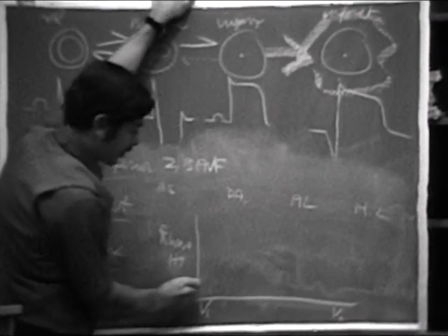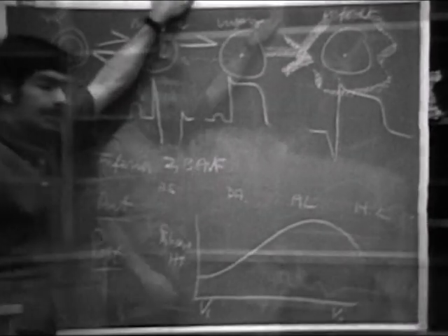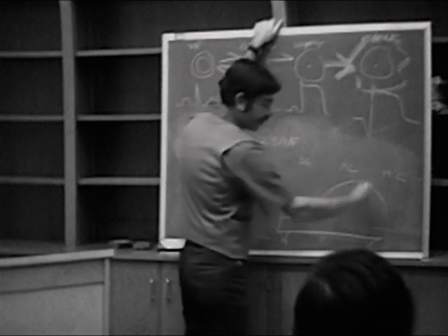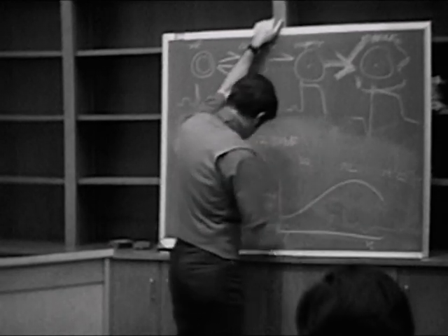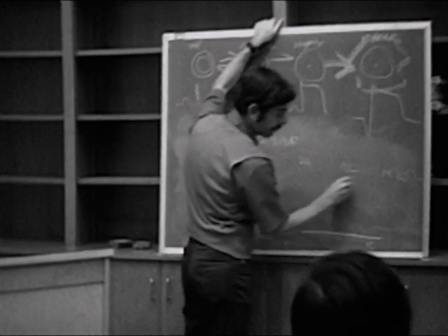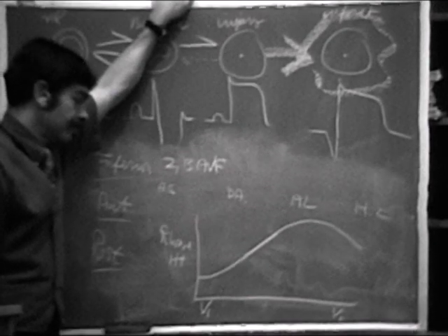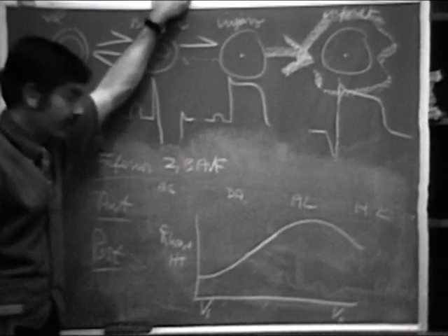And we said that you get a normal R wave progression that looks something like this. Right? As you go around over towards V6, perhaps I should draw this. The peak of the R wave is generally around V4. Okay, so this would be a normal R wave progression.